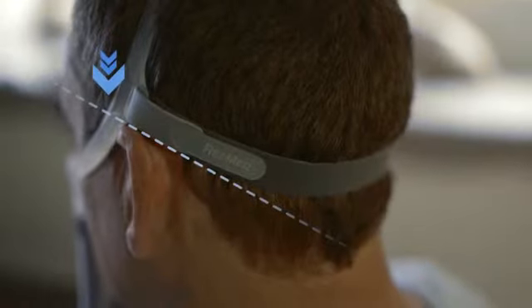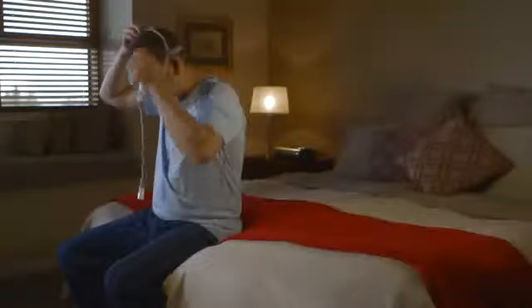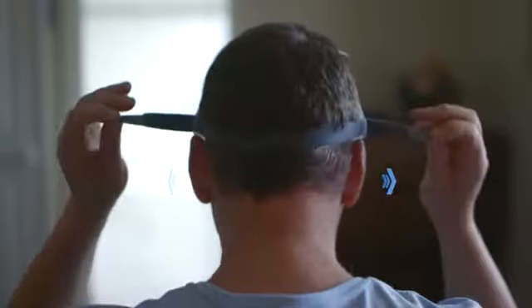Remember, the back strap should sit just above the ears, at the back of the head, over your hair. Make sure that the mask's cushion is the right way up. If you're feeling too much pressure or tightness at the bottom of your nose, loosen the top strap and then try adjusting the back strap.